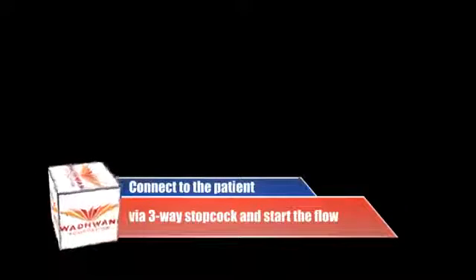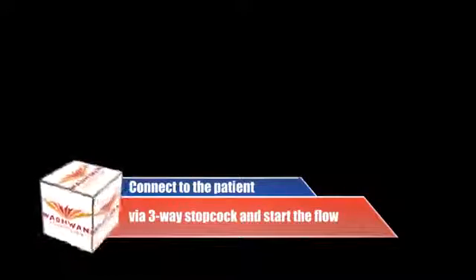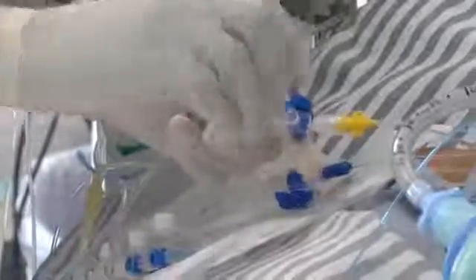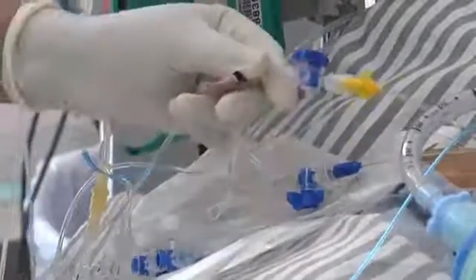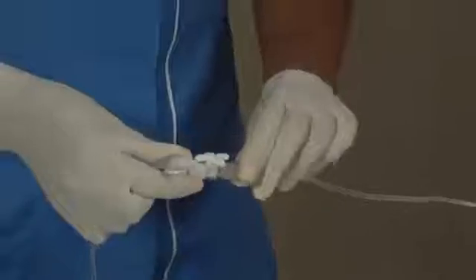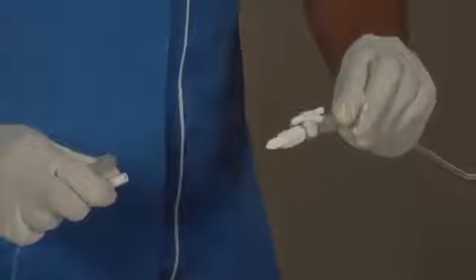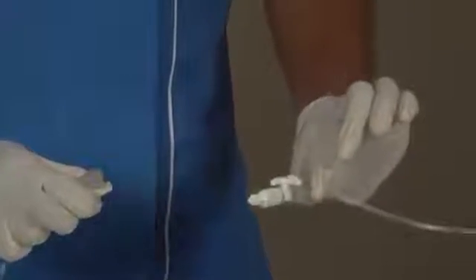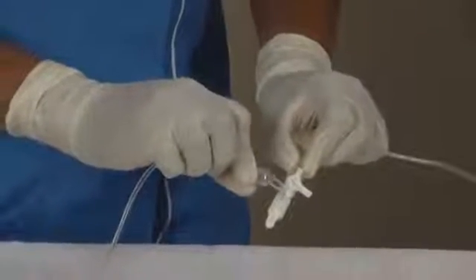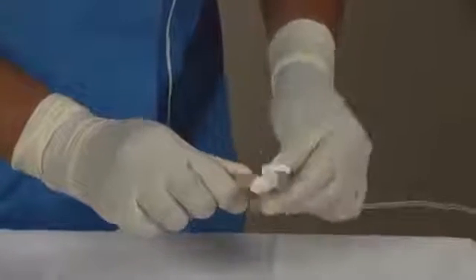Now we should connect the feeder tube to the patient via the central or peripheral line. We connect the end of the feeder pipe to the three-way stopcock. This is the three-way stopcock. This pipe is from the patient's side. Now I am going to connect this pipe to the three-way valve. The three-way stopcock should be blocking the entry connector where this line will join.